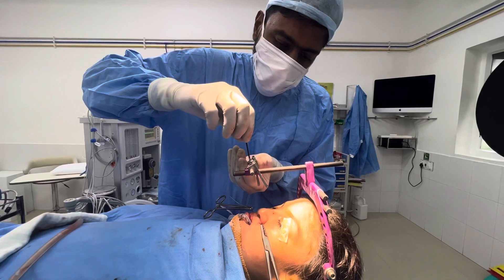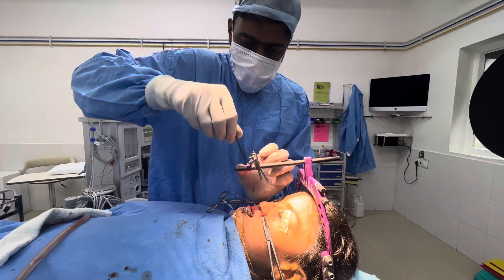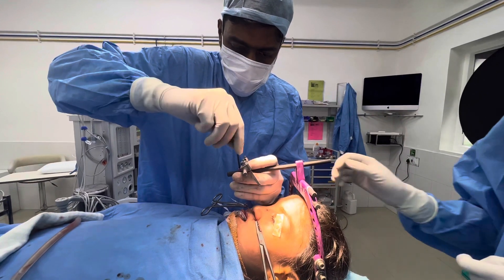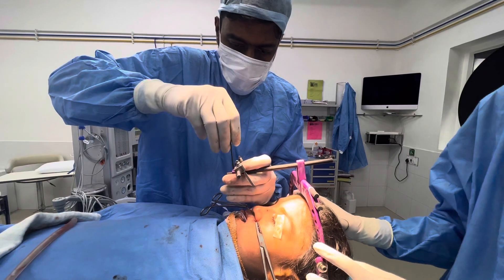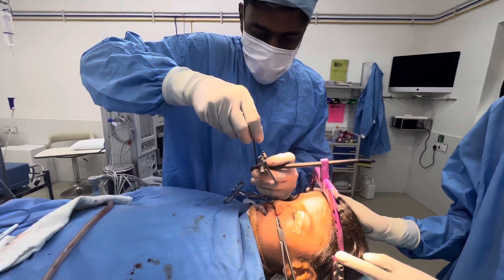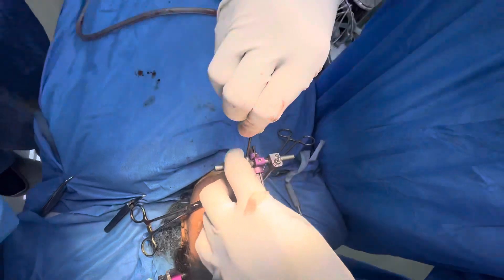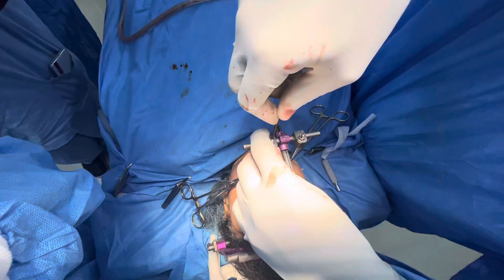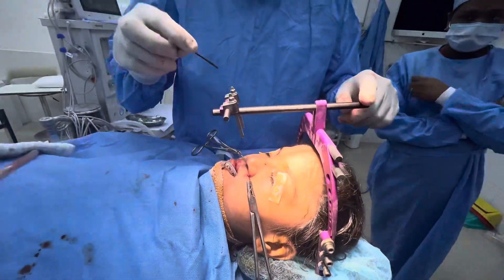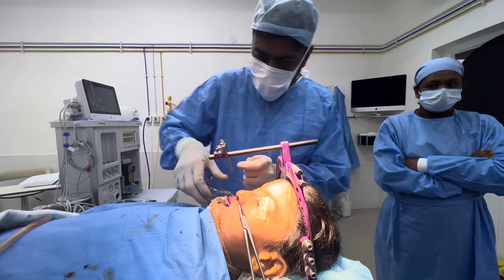Now we are going to change the angle of this a little bit. Each part of the apparatus here can be adjusted, so I'm going to move this a little bit down. This is the central rod, and these are the distraction devices. There's a small slot here.